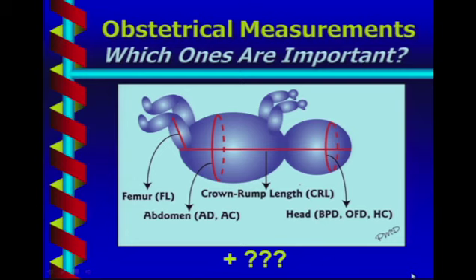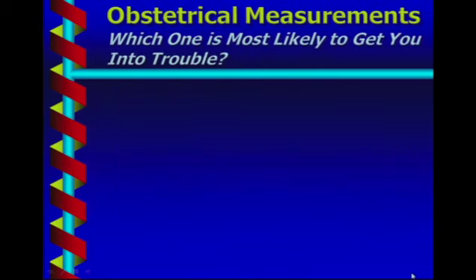elements that I'll be focusing on is of the various other measurements that one could measure, which ones are important to measure, especially on a routine obstetrical ultrasound. One of the questions, I'll pose a question at the beginning and come back to it at the end.